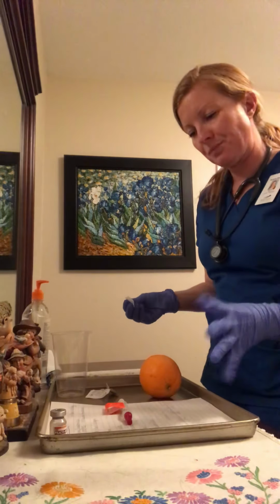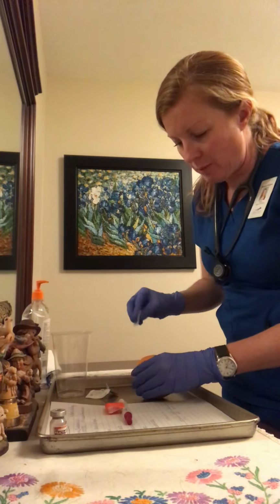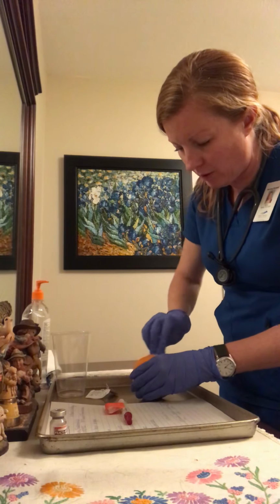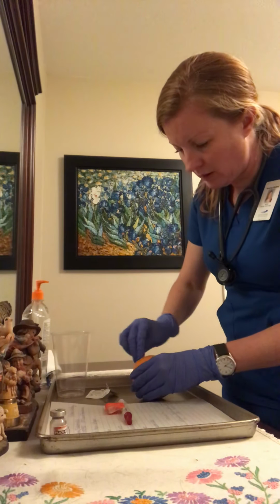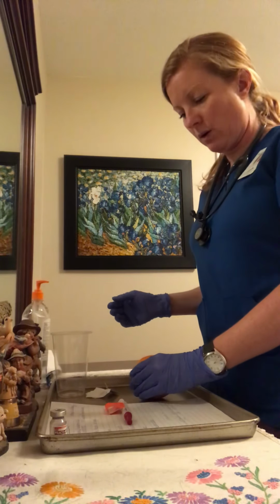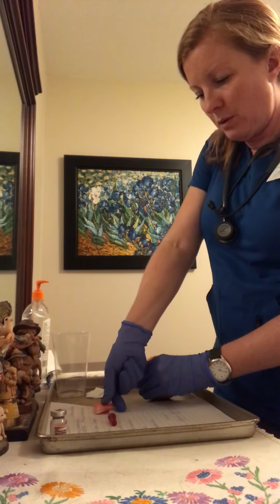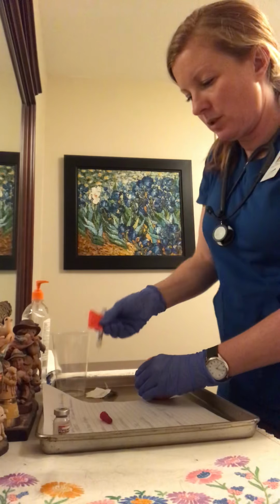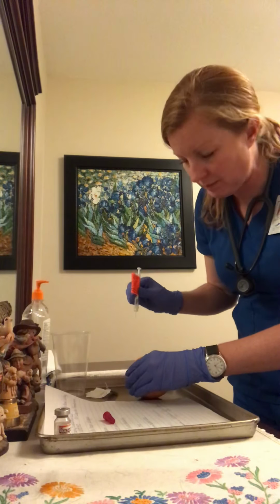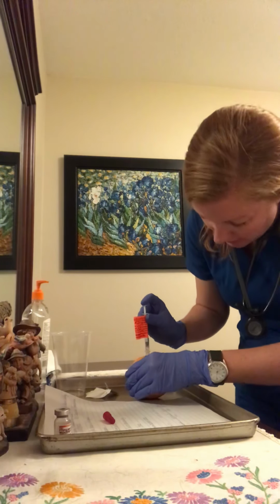I'm going to bunch and hold. I'm going to cleanse the spot, starting in the middle, working my way out with the alcohol. Okay. I'm going to hold the bunch, let the alcohol dry, and then I am going to pick up my syringe. I'm going to let the patient know that there will be a poke. There's a poke coming. I'm going to dart it in at 90 degrees, and then I'm going to inject it slowly.